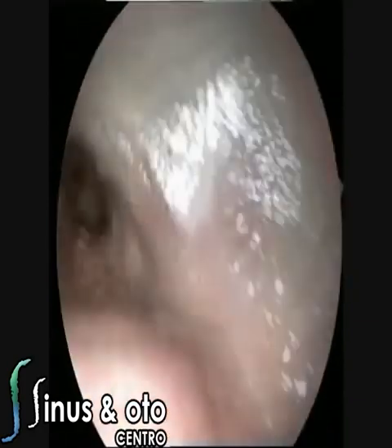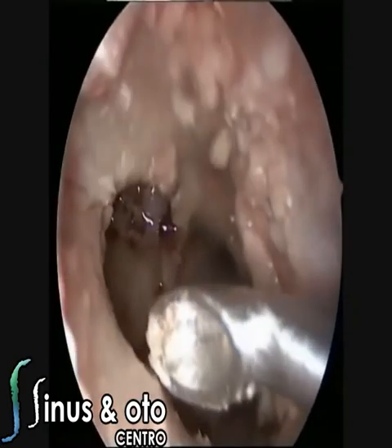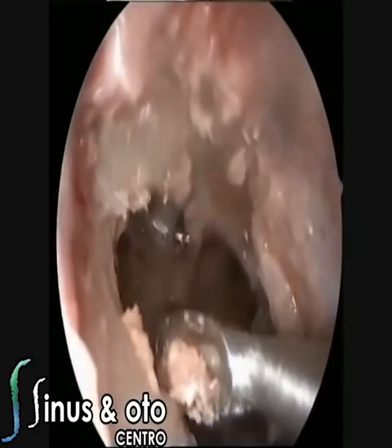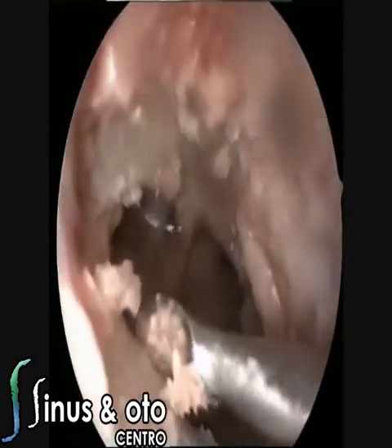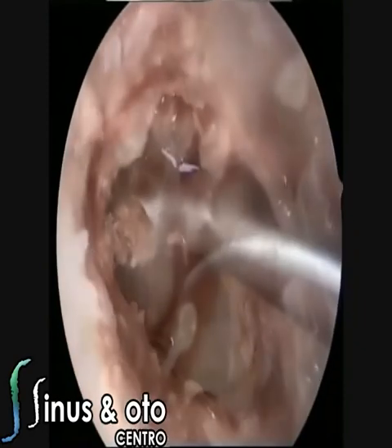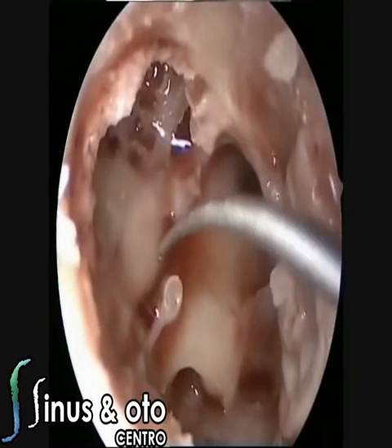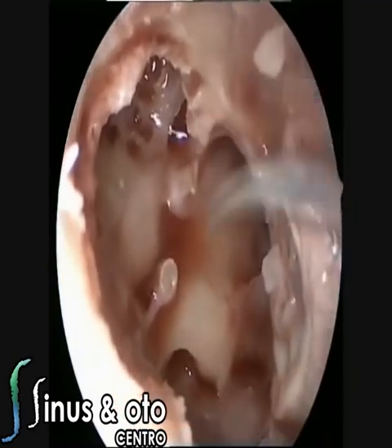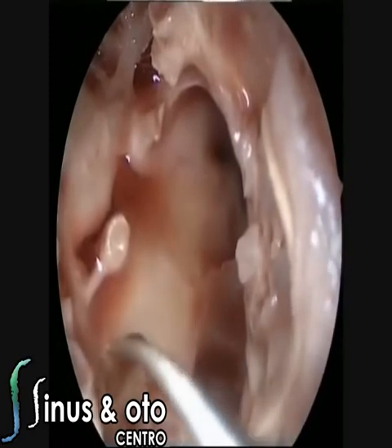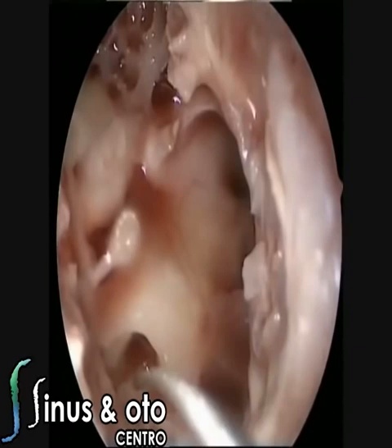Of course, when you have problems in the mastoid, sometimes you need to drill, and sometimes you need to do a temporal bone dissection, a temporal bone surgery, I would say. But in some cases, the disease is restricted to the middle ear, and in most of the cases of inflammatory conditions, the disease starts at the middle ear. So the middle ear is the birthplace of the disease. So we should always start our surgery for inflammatory conditions in the middle ear, through the middle ear.